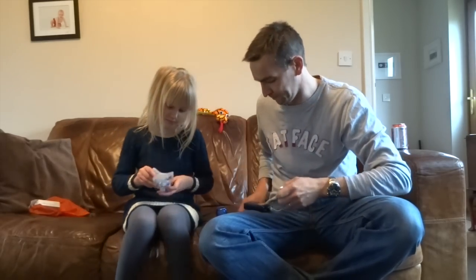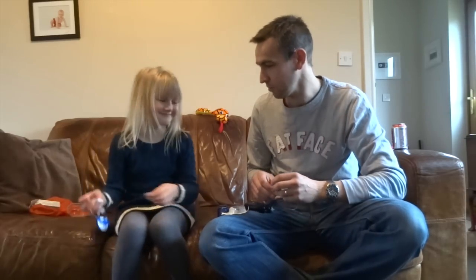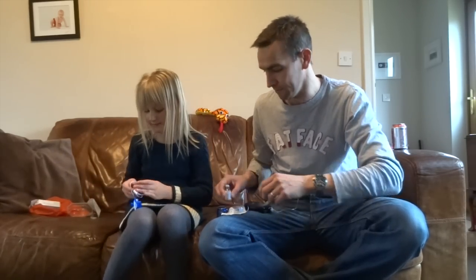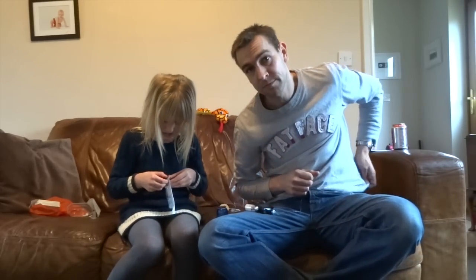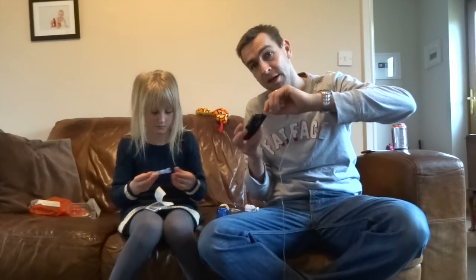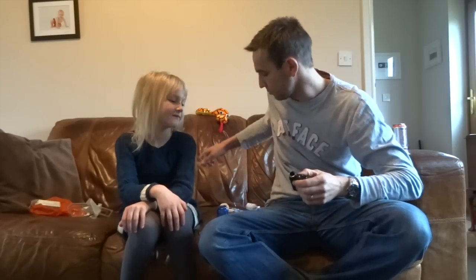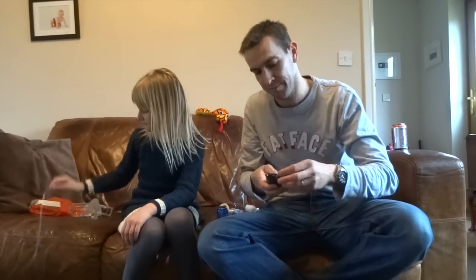Open it up. Where's all the rubbish go? Into one pile. What else needs to be opened? And while she's doing that, I'll disconnect the old one. So that's come out of there. We'll take that out of the pump. So now we are pump without that. Where's that go? Rubbish.